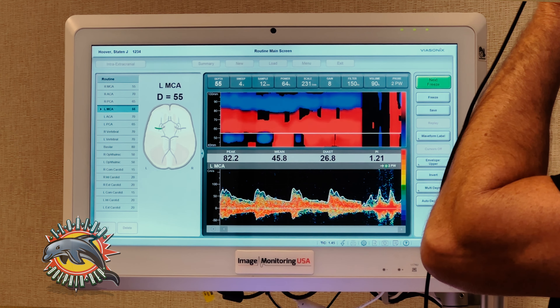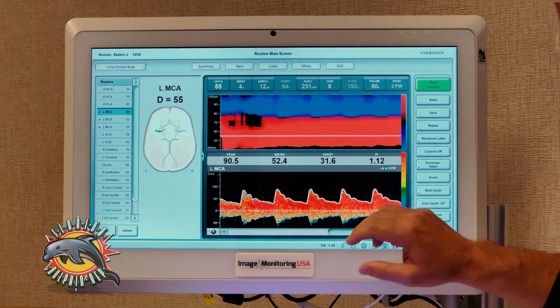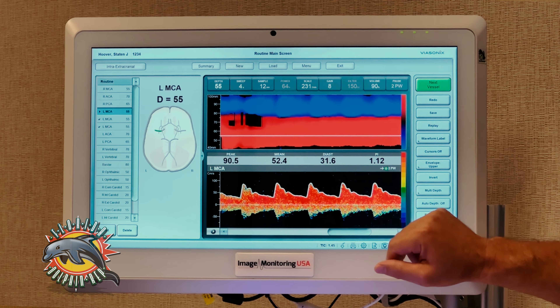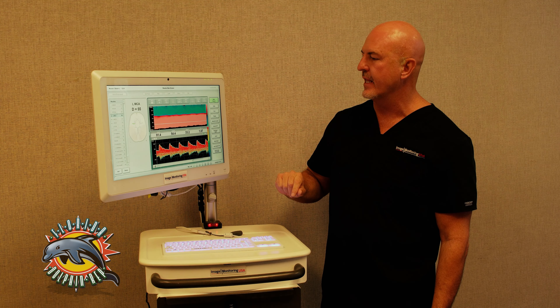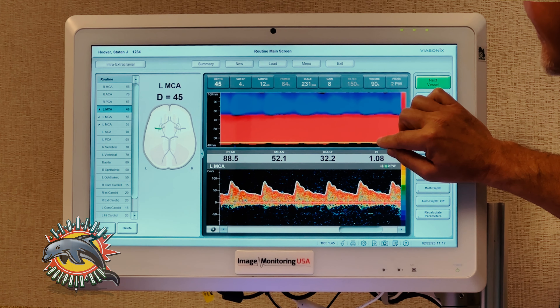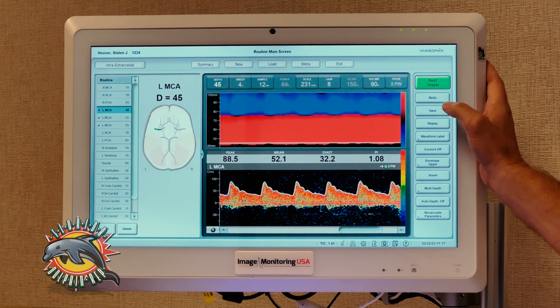Okay, so you saw how fast I was able to get on my MCA. However, I have more than just my MCA here. My first save was at a depth of 55 for my left MCA.